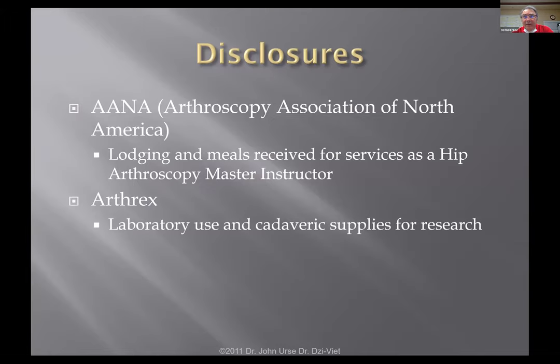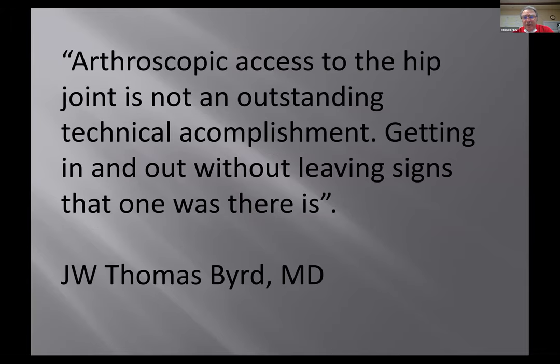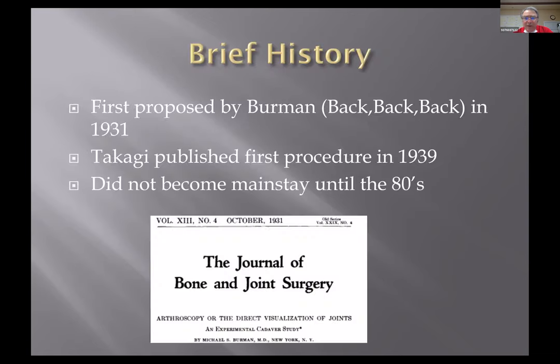And then in about the year 2000, the hip impingement concept started with Dr. Ganz because they were doing these hip osteotomies. So I'm going to talk a little bit about that. And then it was a matter of hip impingement. Everybody's got hip impingement, but we found out there were a lot of other things in the hip. So our goal, if we're going to get into a hip, is to get in without leaving a bunch of marks that said you were there.